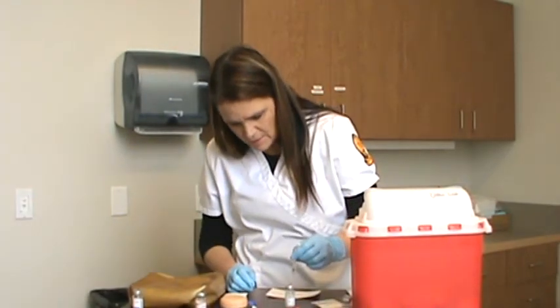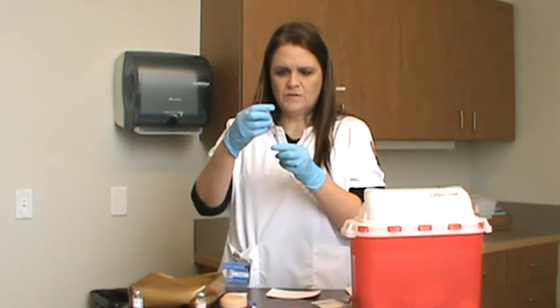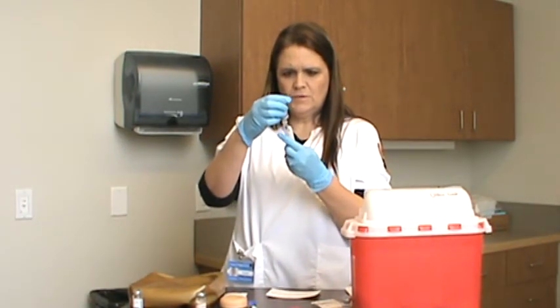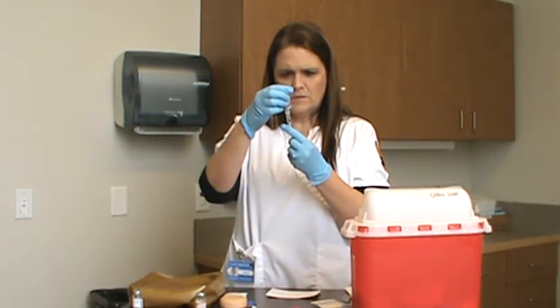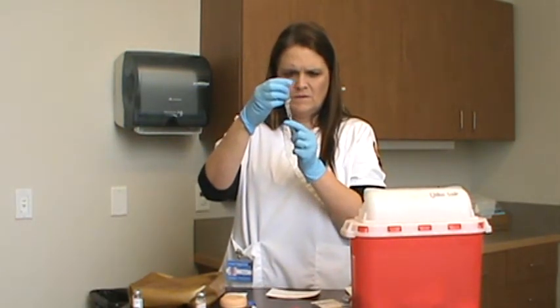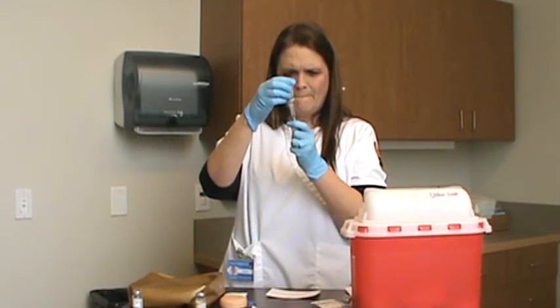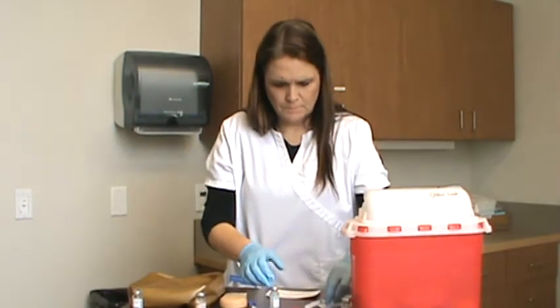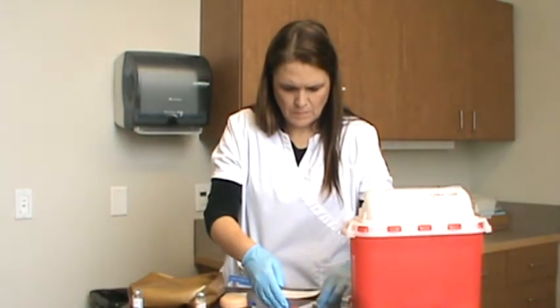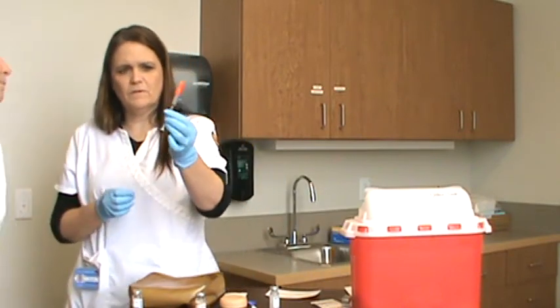With this, if I drew up too much, I would have to start again because you can't push any back in. 25. Check, and this is 25.